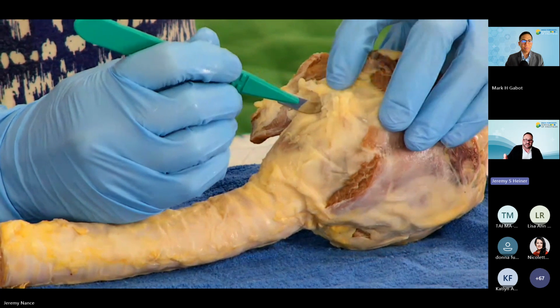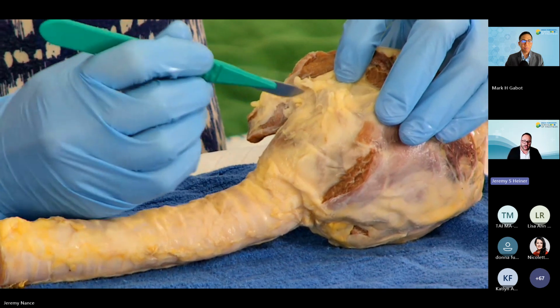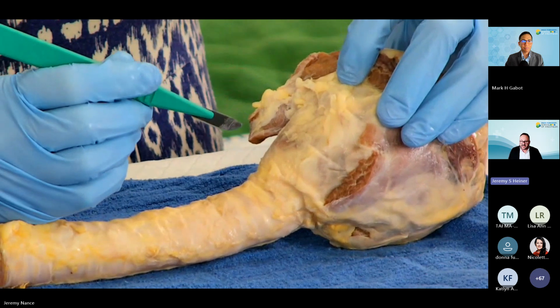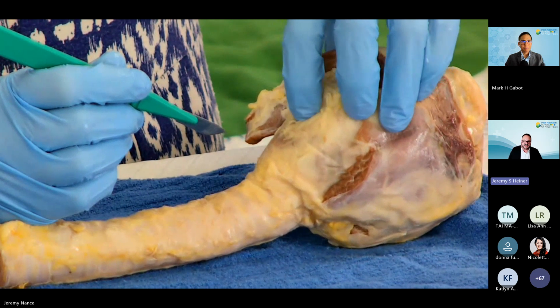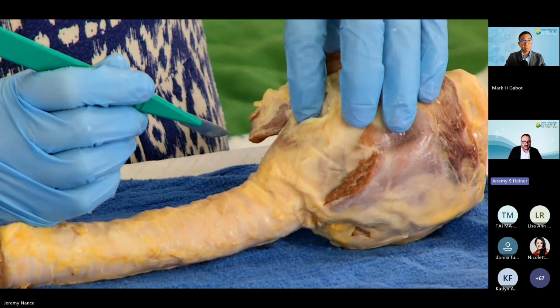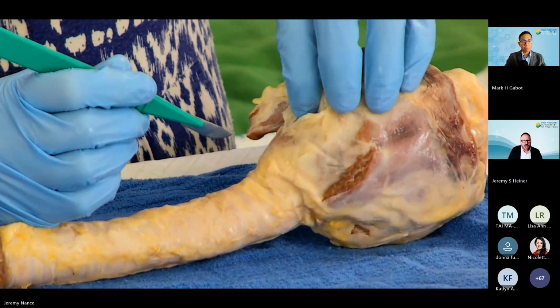Now, of course, if we were doing this in real life, there would be skin and adipose tissue to go through as well. But that would be the vertical incision, which opens up the tissue. And then once we move the scalpel out of the way, you can see that Nicolette is dissecting some of that tissue with her index finger, and she has the ability to better palpate the anterior neck.